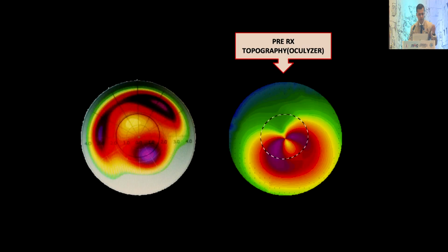Just going to finish off saying that if you look at topo-guided treatment, this is an age where everything is changing. The whole world of refractive surgery is changing into lenticule-based surgeries. But what we need to understand is the primary reason we are doing a surgery for patients is for vision. And when it comes to vision, the crisper you can treat, the better the patient's vision is. So in my hands, topo-guided treatment or Contoura Vision works favorably, and almost all patients are very happy and comfortable within 24 hours of surgery, and most patients see more than one line at the end of the day.